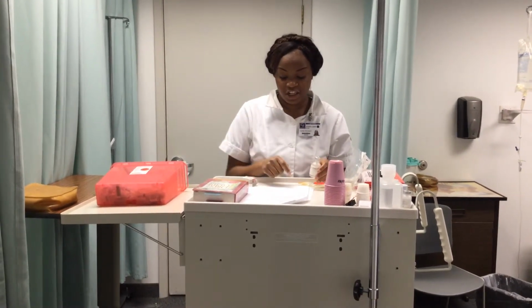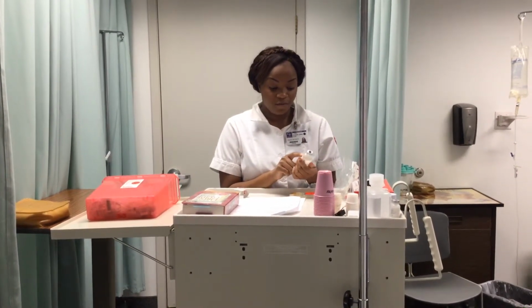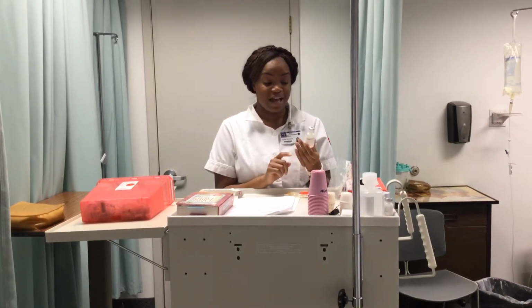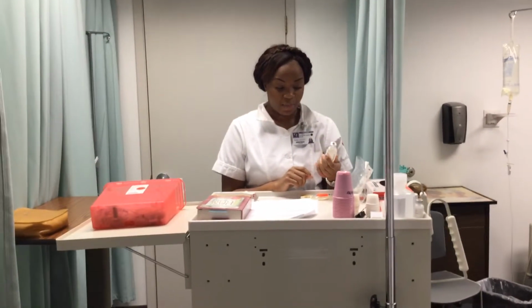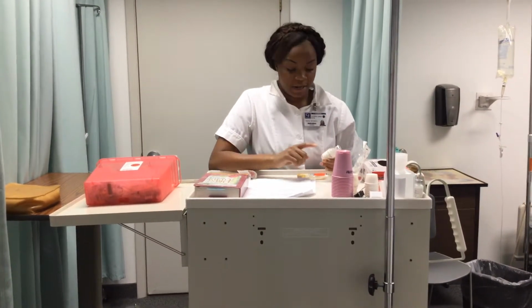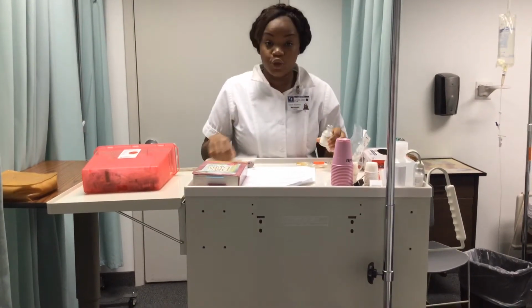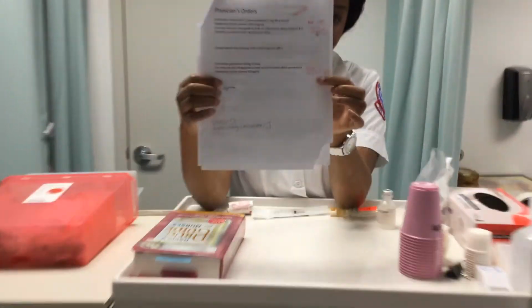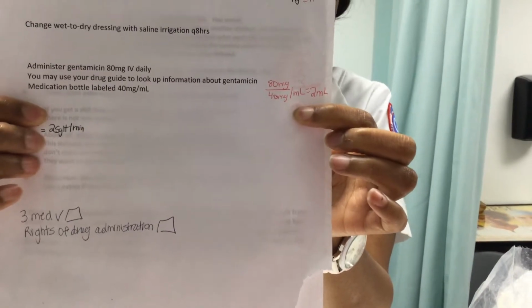Now, my order states that I should give gentamicin 80 milligrams. The medication that I have on hand is gentamicin 40 milligrams per ml. The expiration date is January 15, 2017, so it's not expired. It's a multi-use vial. The contents are clear, and I can go ahead and use this vial. Because I have to give 80 milligrams and it's only a 40 milligram per ml medication on hand, I need to withdraw 2 mLs of medication in order for me to get the 80. I've also done my dosage calculation here, just to verify what my dose is, what I have on hand, and the amount that I will take from the multi-use vial.